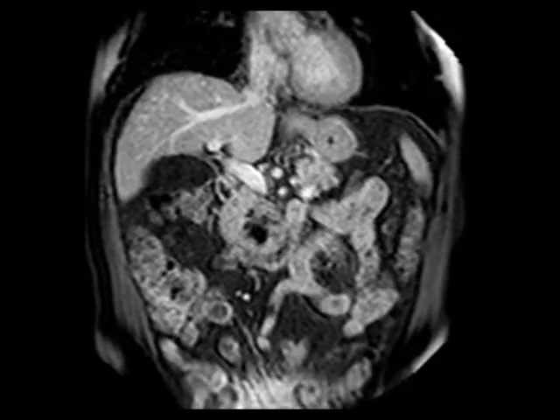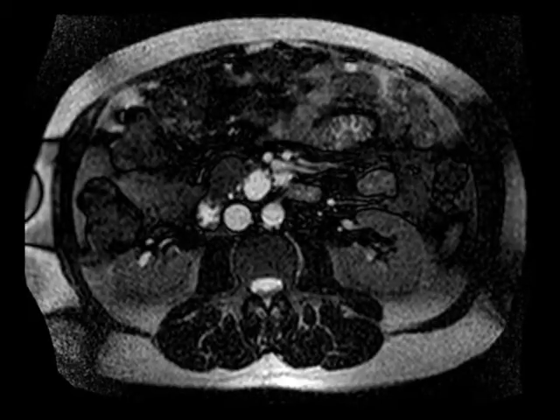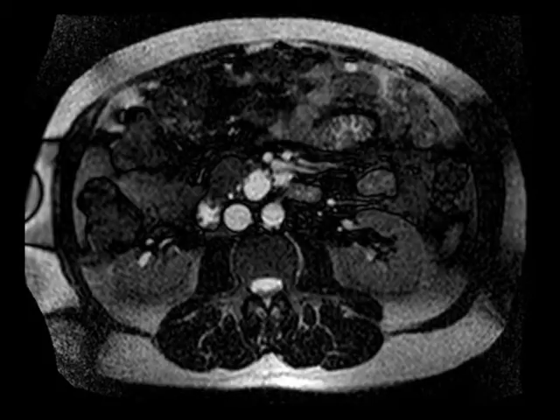This is a classic appearance for a side branch IPMN. It's important in cases with a side branch IPMN that you risk stratify the lesion. Things that make you worried about a lesion having a greater chance of malignancy include size, particularly size over three centimeters.